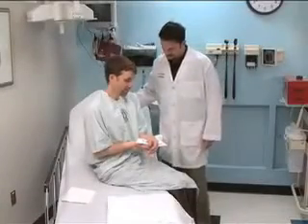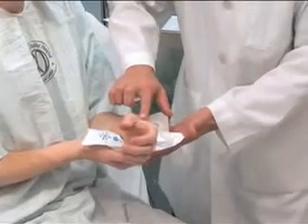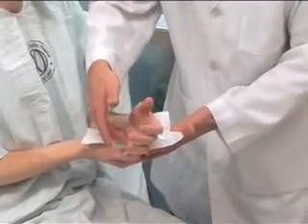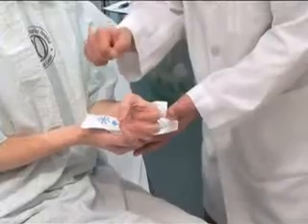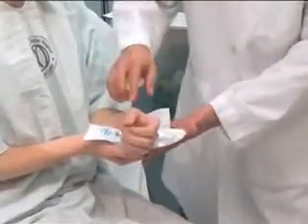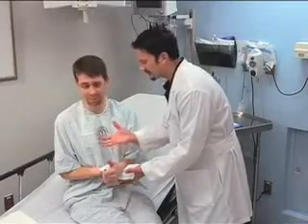Before placing a splint, carefully examine the injured extremity. Failure to expose the injury site fully may result in unidentified injuries and subsequent poor outcomes. Evaluate pulses, motor function, and sensory function to determine whether emergency intervention or evaluation by a specialist is necessary. Treat skin or soft tissue injuries appropriately before placing a splint.